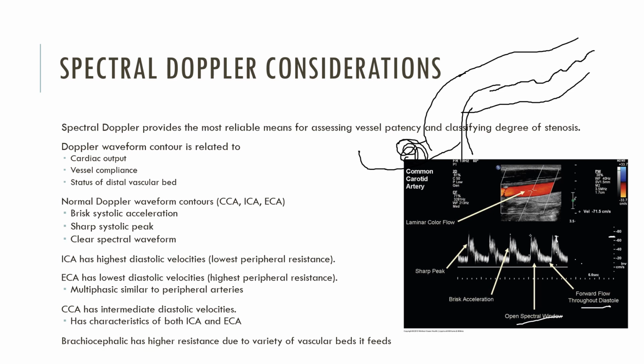It's really the same idea when we're looking at our Doppler flows. You don't have to be in this turbulent area to tell you that you have just been down a waterfall. You'll know that ahead of time. You don't have to be in the waterfall itself to know that there's a waterfall there. You can tell that ahead of time.